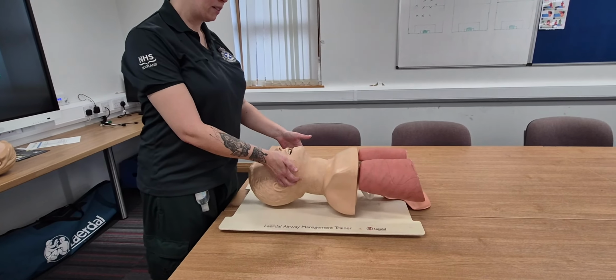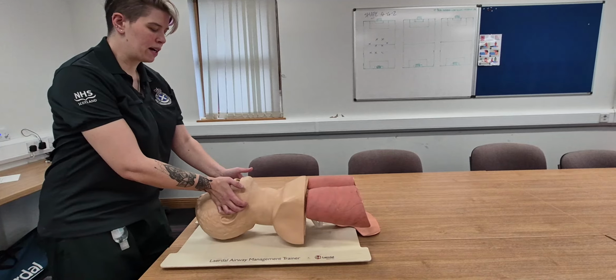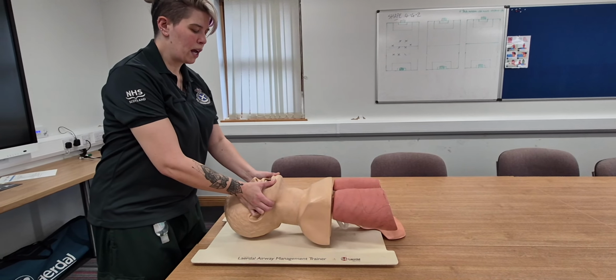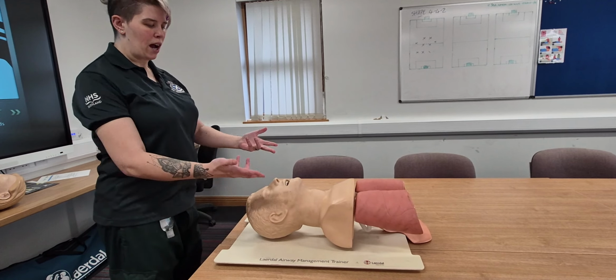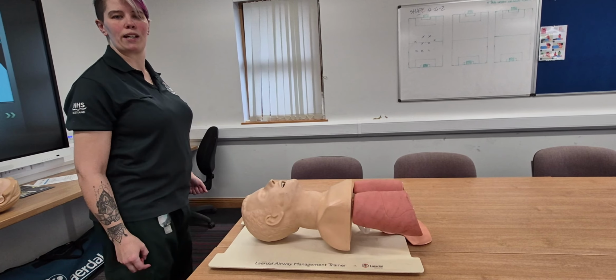Again, with the flat aspect there, fingers go into the back of the mandible, pulling it forward and opening the jaw like so. As I say, this is currently an open airway because I've got the tongue off the back of the throat. This is closed, so keep that in mind. You're going to have to keep that position in order to maintain the airway.